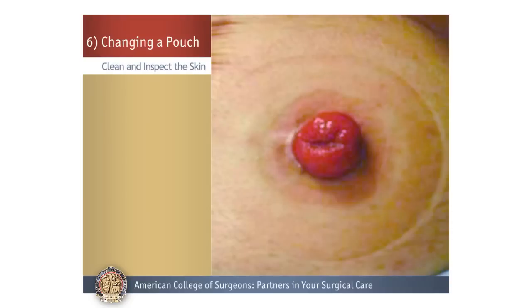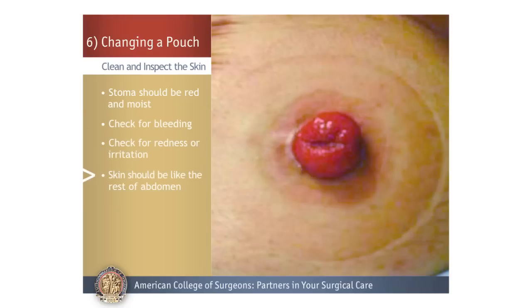Clean and Inspect the Skin. After removing the old pouch, look at your stoma and check the color — it should be red and moist. Also check for any bleeding, which is rare. Then check the skin around the stoma for any redness or irritation. Your skin should look like the rest of the skin on your abdomen.